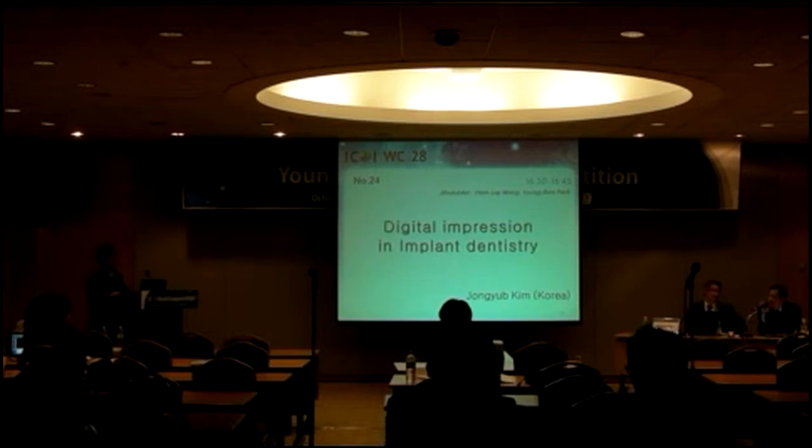The challenge is that digital impression in the US has been talked about, but it's not widely used. The concern is the accuracy of digital impression. I know from your study you show there's no difference from the conventional. But did you actually look into how accurate they are with a metal core versus without a metal core? Yes, we do have more reflection on the metal core, I agree.